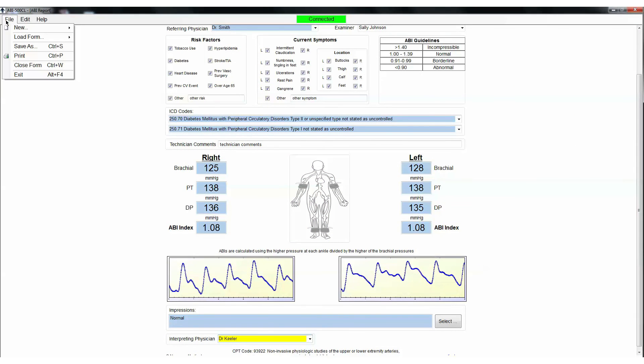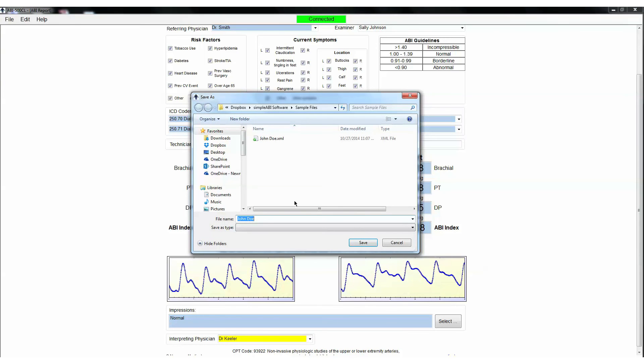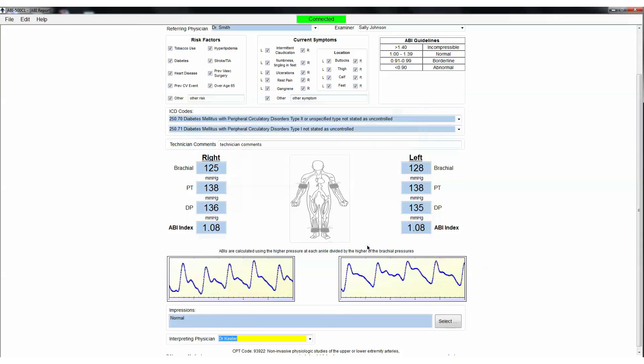When finished, you may add or select impressions in the Impression fields. Save or print the report by going back to the File tab. That's all there is to the ABI exam with your Simple ABI CuffLink. Like any procedure, the ABI becomes easier to do with practice.